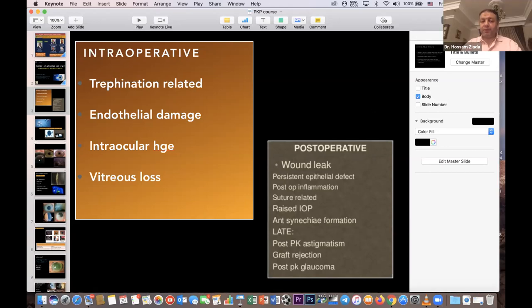Yeah, inside the bag. But during these steps, you will keep your speculum inside, or remove it? No, I don't remove the speculum. As Dr. Asad said, I will choose a speculum which doesn't put pressure on the eye. Okay, but if you didn't find that, you will remove the speculum and use sutures, or what to do? Excuse me, you mean I remove the speculum? Yes, in order not to put posterior chamber pressure. Yeah, I will go for that, but I think it will be very difficult. I didn't face it.